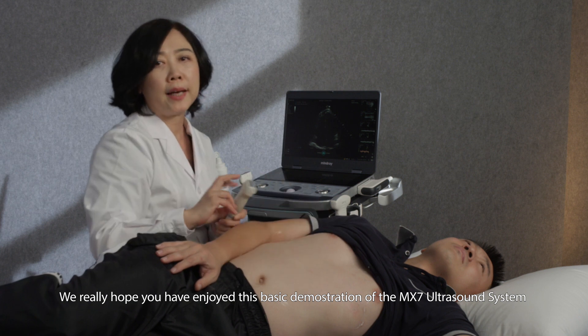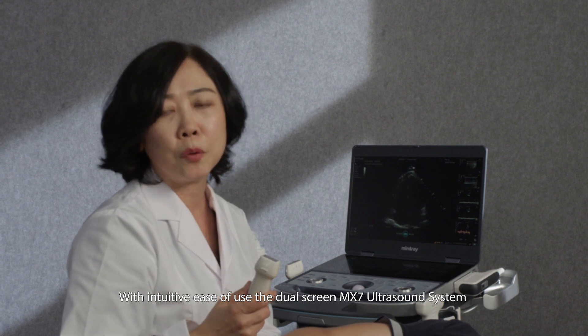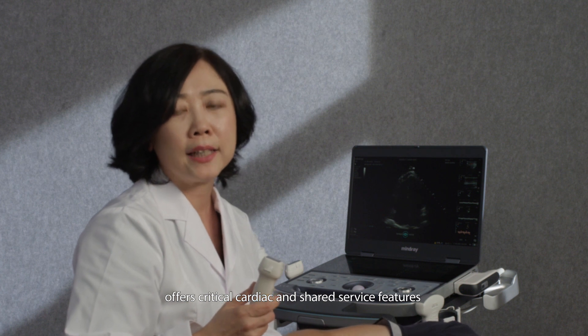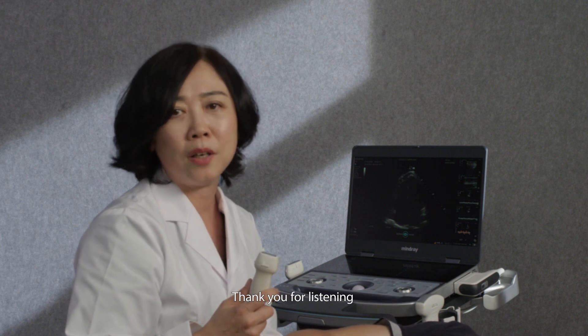We really hope you have enjoyed this basic demonstration of the MX-7 ultrasound system. With intuitive ease of use, the dual-screen MX-7 ultrasound system offers critical cardiac and shared service features to enable you to deliver the best patient care possible. Thank you for listening.